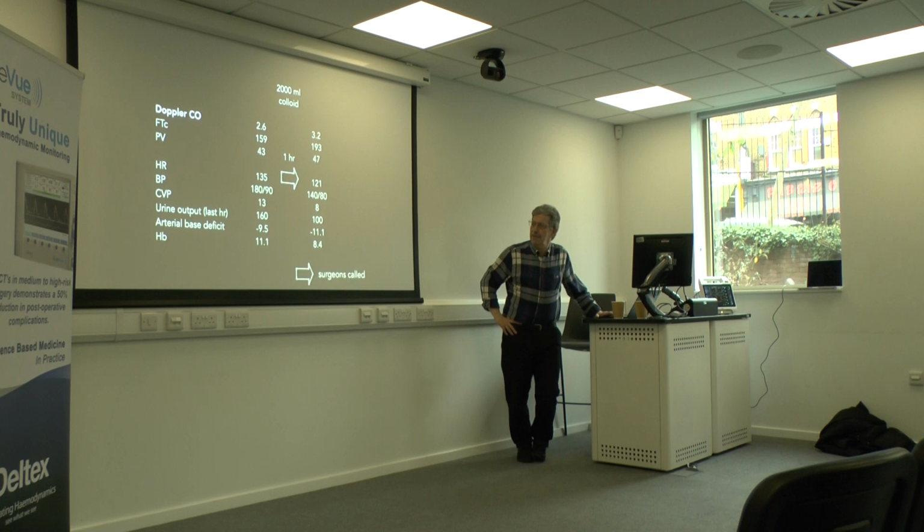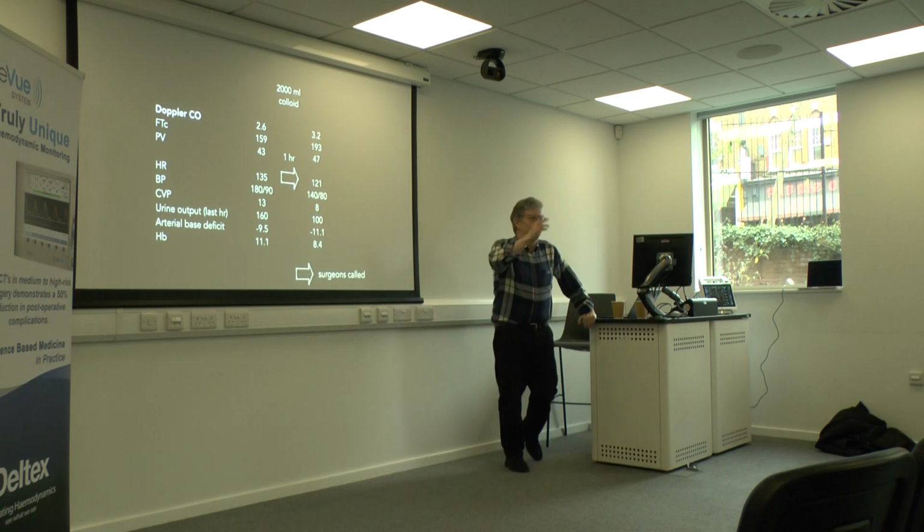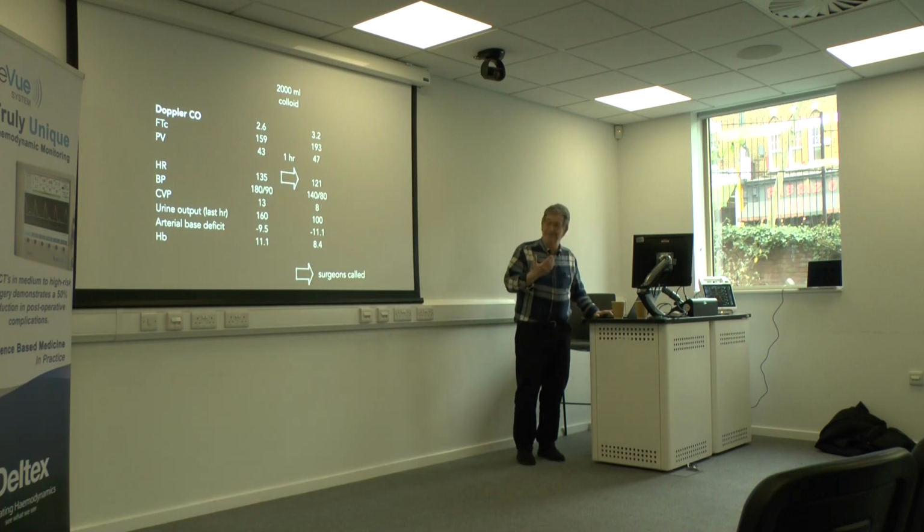So what would you do now? Call the surgeon? No. They were monitoring with the lads up in theatre, and I think they wanted to watch. Heard that one before. And so they couldn't be persuaded. Anyway, we continued.